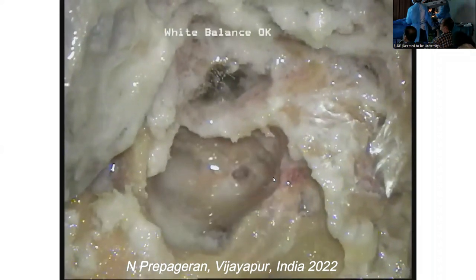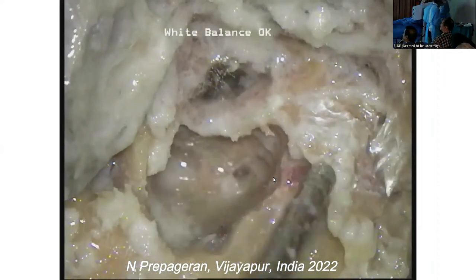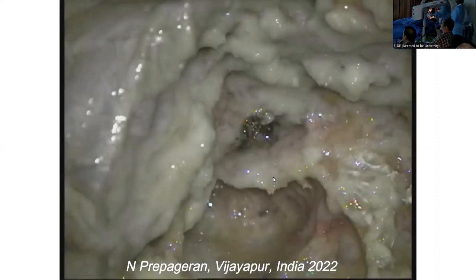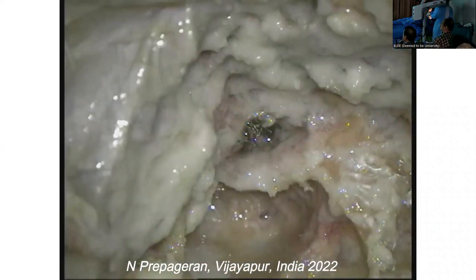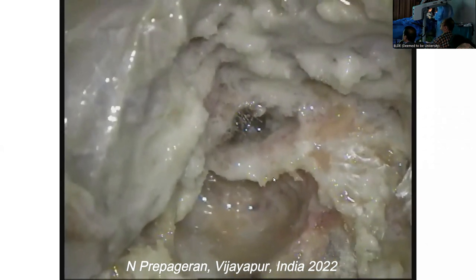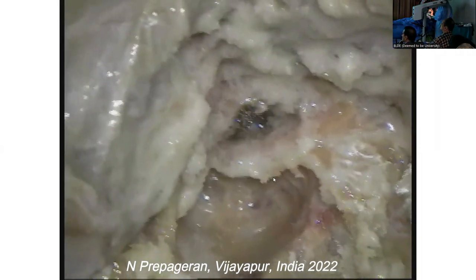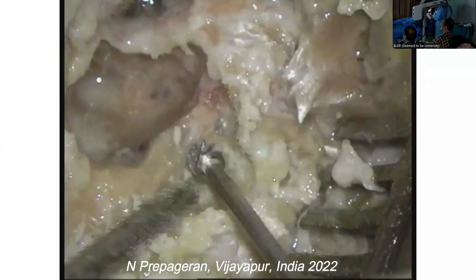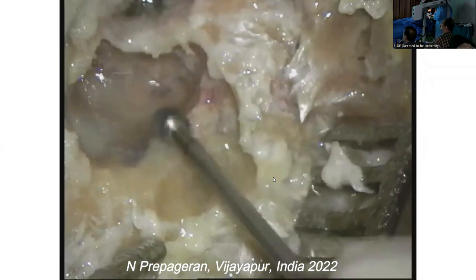Guys, can you see how thick the retro sigmoid bone is? Can you see, guys? Yeah? So that's retro sigmoid now. The canal is centralized. Okay? So I want to find the dura of the retro sigmoid. Oh. Okay. So this is a sigmoid sinus here.